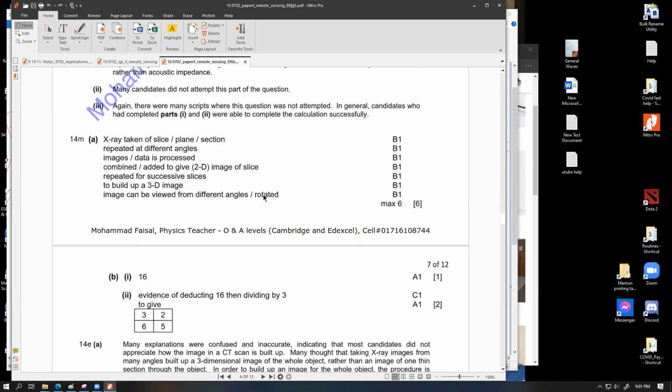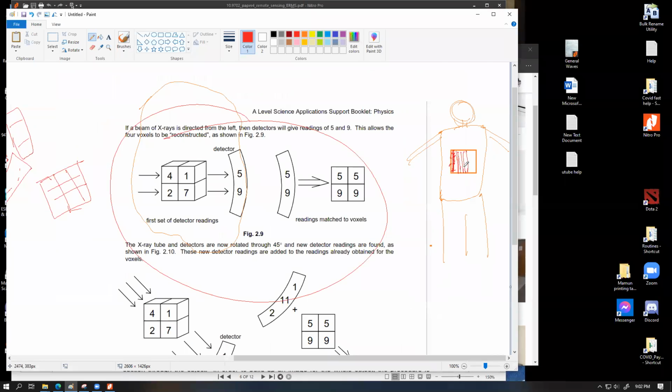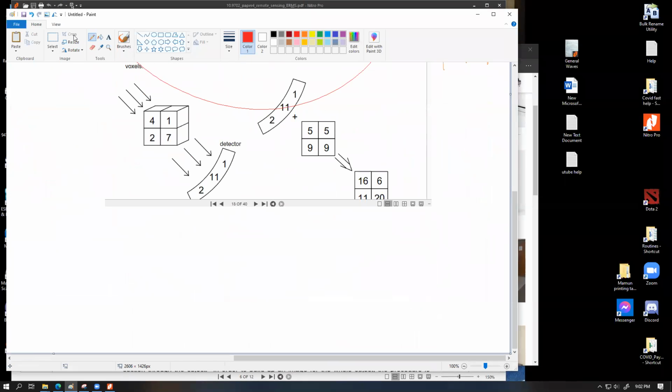So this entire information that we are collecting can be viewed in a computer environment, from which you can take actual information. The way CT scan reports are usually made, printed on paper, is basically the section view, the slice section view of multiple layers where the anomaly is detected. For example, let's say this part is the part of the patient's body that is undergoing CT scan, and let's say this segment of the body looks like this.